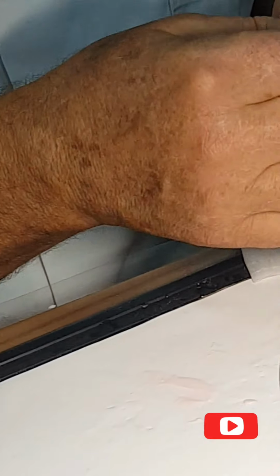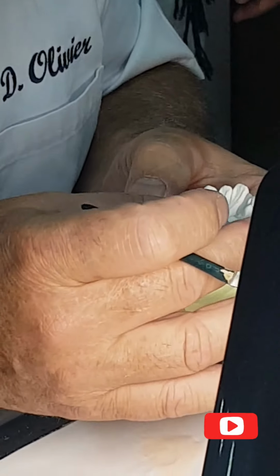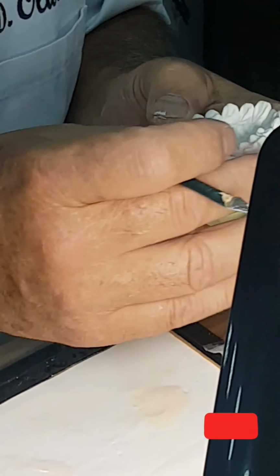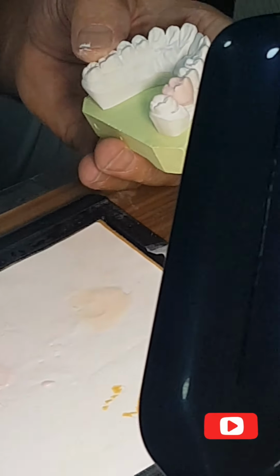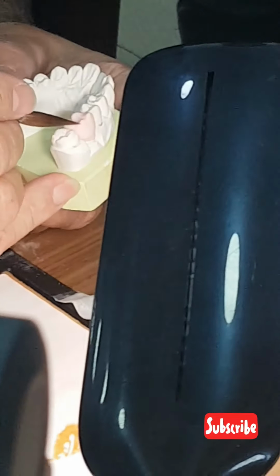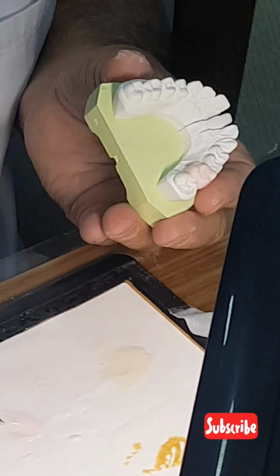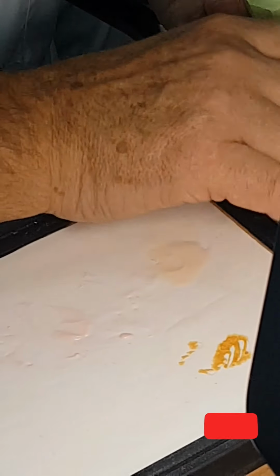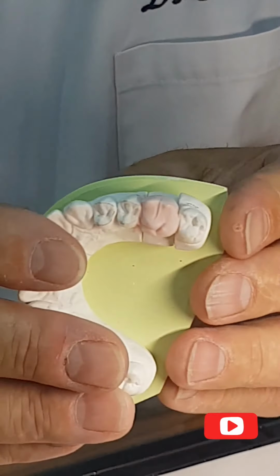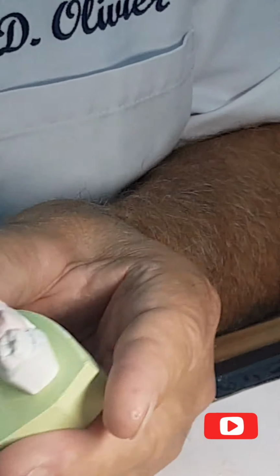And I check. Look, I'm not perfect in the details, but I enter like the premolar and I exit like the molar. You see? That means my molar is in the shape of that mouth. And here, at the end, I will add the parabolic cusp, here, in that area. You see? I translate the premolar, I get out with the molar, like a molar.